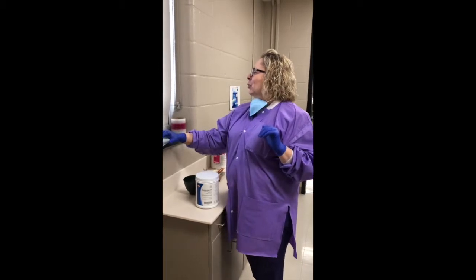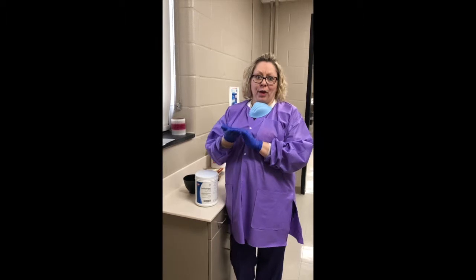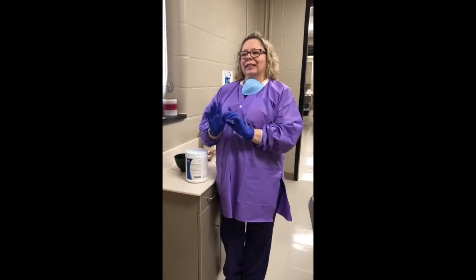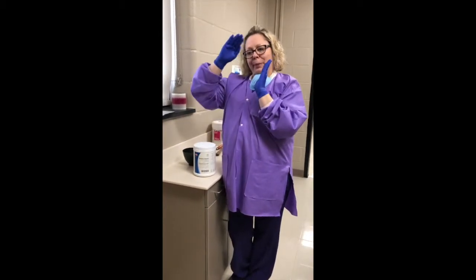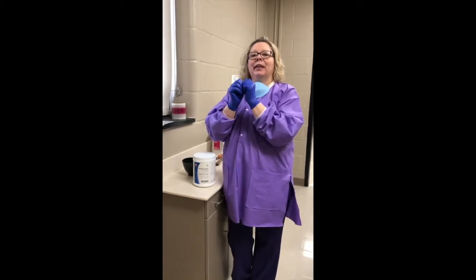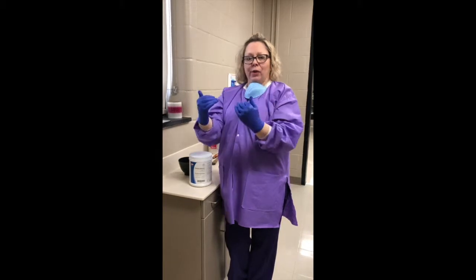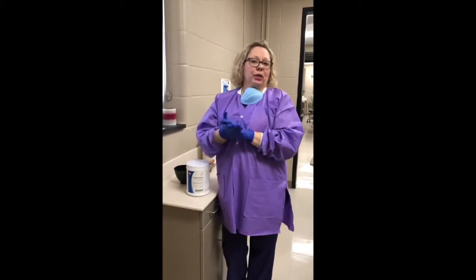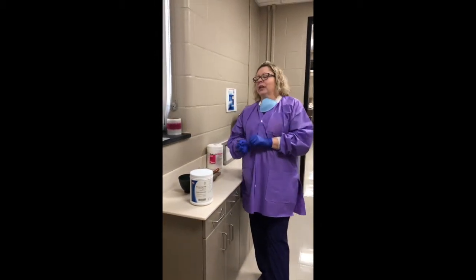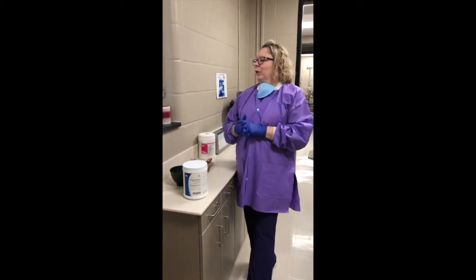And then the final thing is, once we get the tray with the material seated inside the mouth, the last objective is to learn how to remove it properly. So we generally stick one finger up inside to pull down and snap the seal, because it will suction to your palate. Once you are able to snap the seal on one side, you just pull it straight down and out of the mouth, and that helps to not distort the image very much. Sometimes you can tear the alginate material, and if you did that, then you have to start all over to get a complete impression.